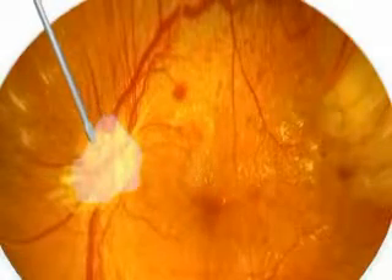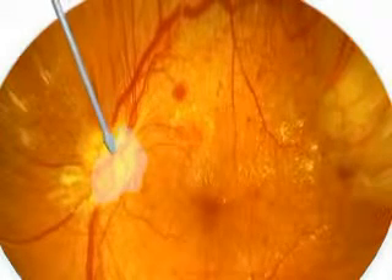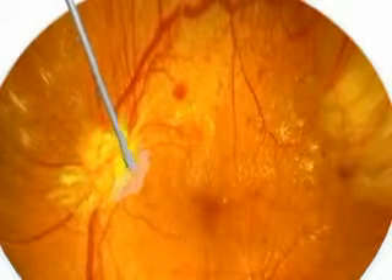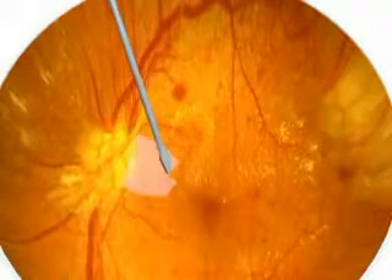To tackle diabetic membrane during vitrectomy is a very challenging situation, specially when there is a persistent oozing from the disc despite raised intraocular pressure, where we cannot use diathermy to tackle this situation.